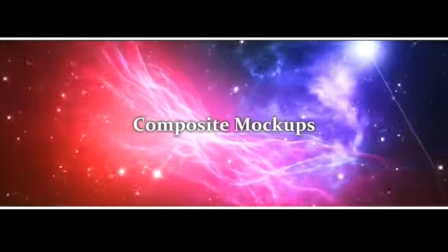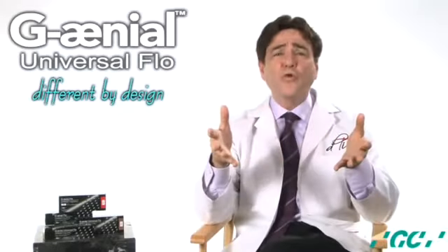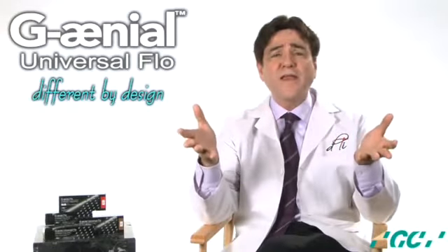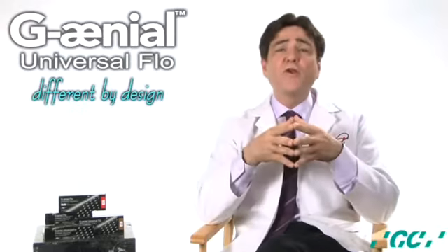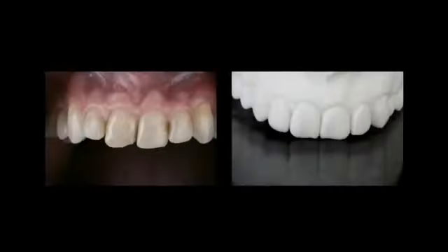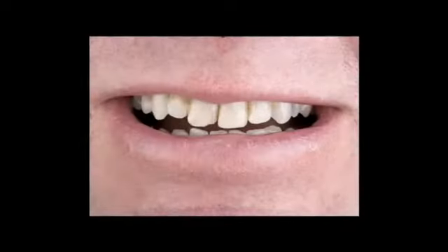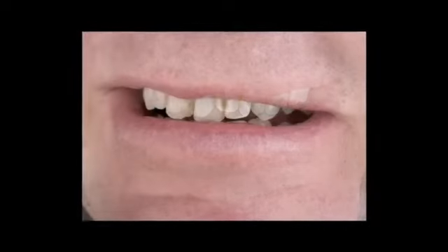For composite mockups, the composite mockup is an excellent tool for increasing the patient's understanding and education of the clinical procedure through a visual prototype. This composite prototype allows the patient and the restorative team to establish parameters for lip profile, incisal edge position and length, and orientation to the gingiva, and to simulate the final result.